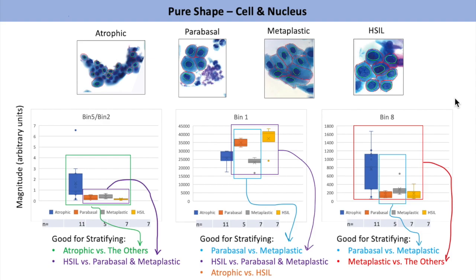So I'd like to remind you that our goal is to show that ShapeGenie can produce clear data separating these in-between categories that can be very difficult for a pathologist to objectively identify when examining these cells under a microscope. ShapeGenie can provide clean data such that 1, we can identify unknown substages, and 2, we can develop automated machine learning models that will analyze PAP smear images to help pathologists speed up the process of diagnosis. Furthermore, once we identify substages or subgroups, that will help us develop and test improved therapies.